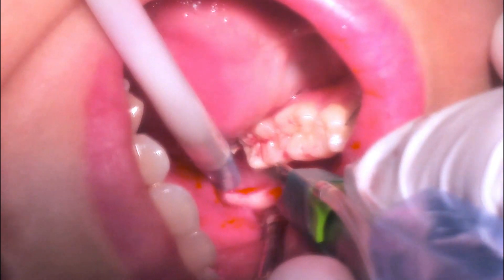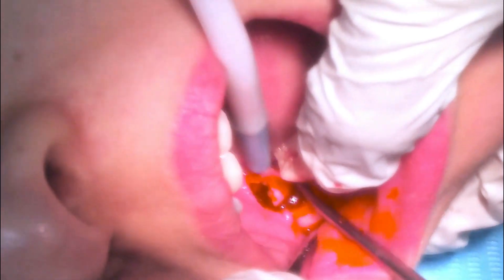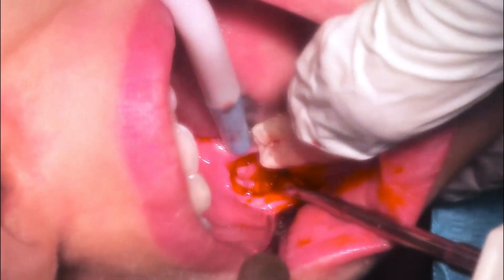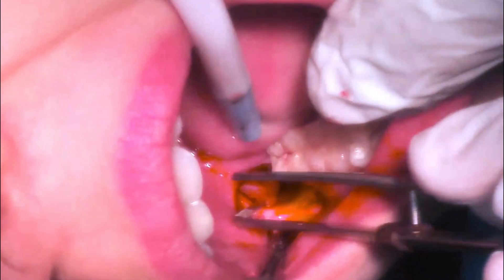It is important at this point to take care of the second molar root and not damage it. The mesial root is slowly elevated out of the socket. Then I remove the second root, which was placed slightly more lingually, followed by the third root — the curved distal root.